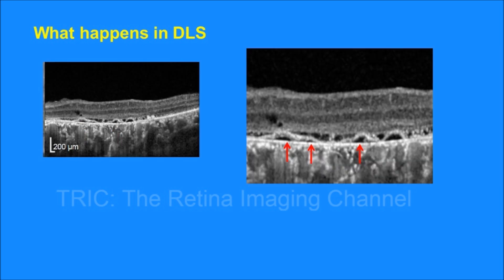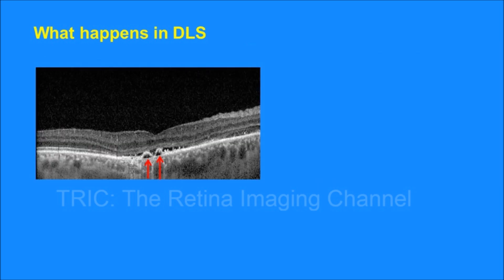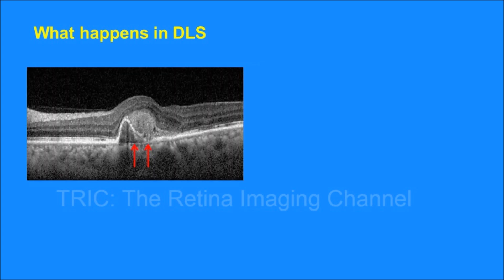Another eye with DLS. Here too we note a second line beneath the elevated RPE, and that is very well seen in the blown out image. Few more images of DLS. This linear scan OCT shows small RPE elevations with a second line beneath it, which is the DLS. In this image again we see RPE elevations with a second line marked by the red arrow, which signifies double layer sign.